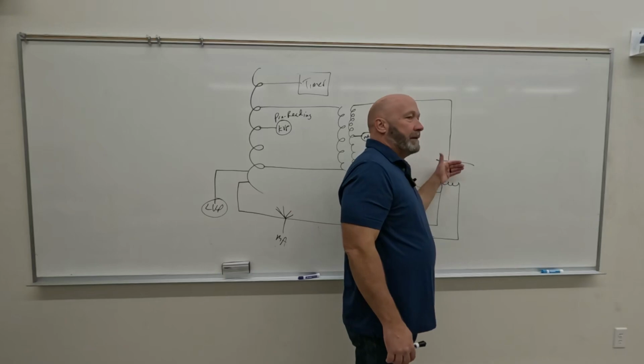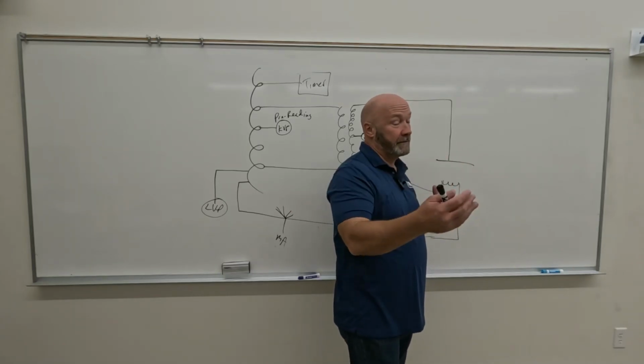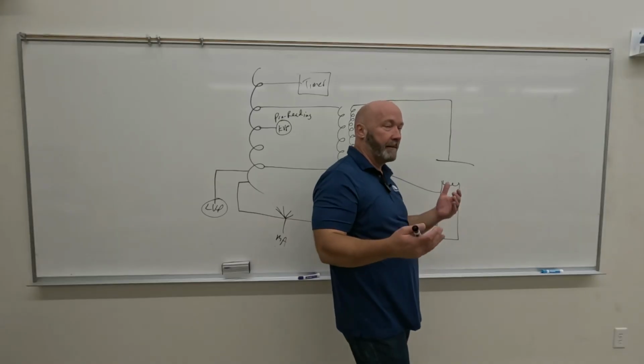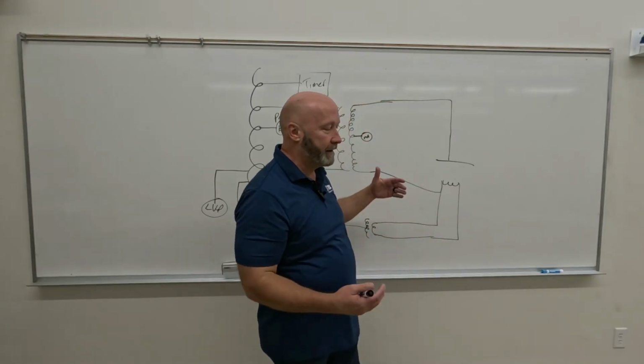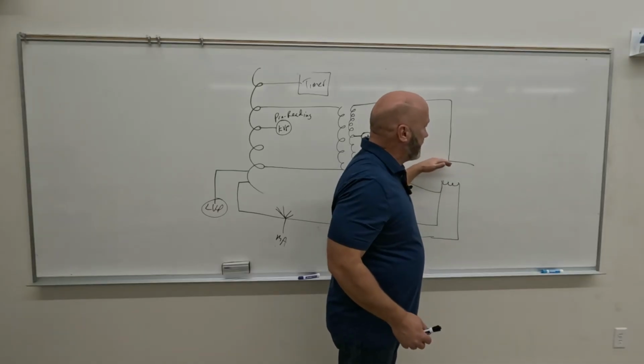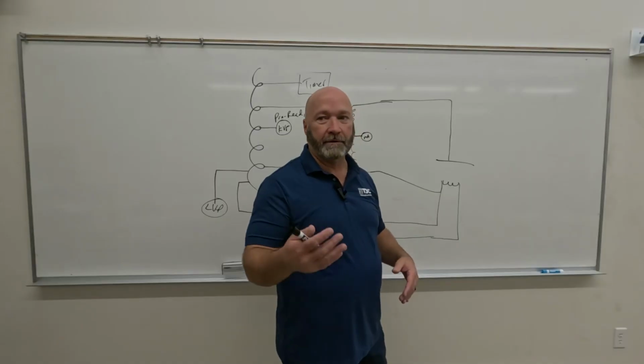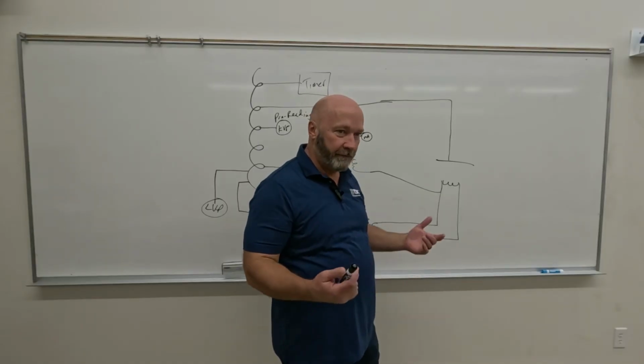But even if that wasn't a potential, which it is, it could happen. It's probably not, but it's a potential. All right, so even if that wasn't a potential, how efficient is X-ray creation just in general? Very inefficient. Very inefficient, right?